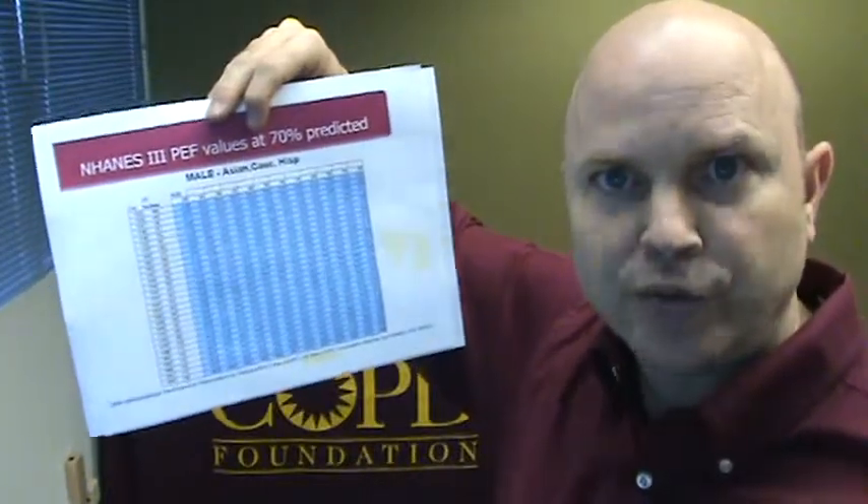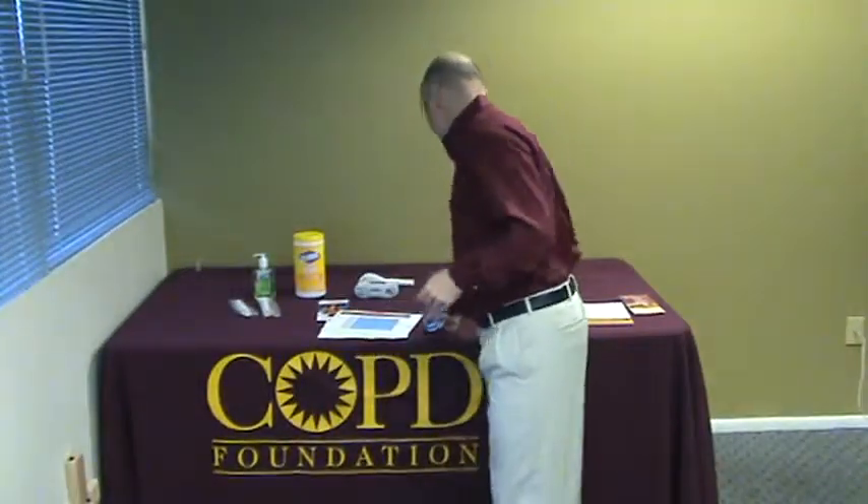If somebody's peak flow is below 382, that would be an abnormal test and they would move on to the spirometry station. Once they move on to spirometry, you would perform the spirometry as demonstrated in the previous tutorials and record the data down on the report card, then educate the patient about the results and about COPD and lung health.